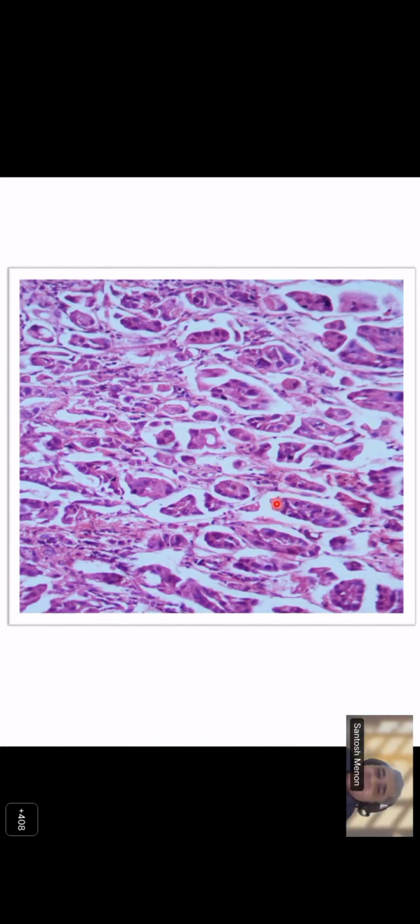Yes, sir. Generally a carcinoid or a neuroendocrine tumor in the bladder is not a very common occurrence. What you get in bladder is usually a small cell carcinoma of the bladder. That is again almost always associated with high-grade urothelial carcinoma in most of the cases. In neuroendocrine tumors, you may find these retraction kind of spaces. You are perfectly right, but the nuclear features are very smudgy and dirty looking in this, and they don't comply with a carcinoid kind of appearance, I'll say. That's important. Yeah, fine.